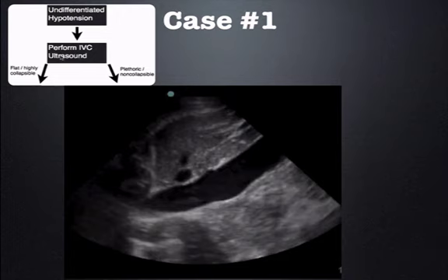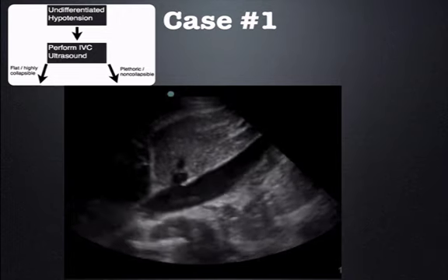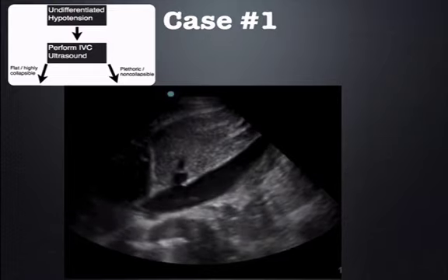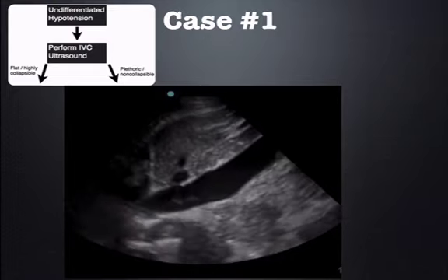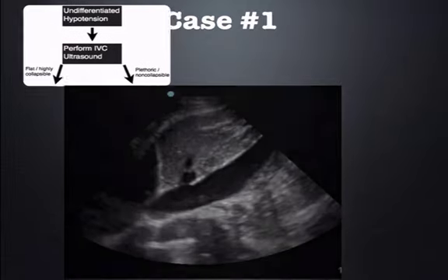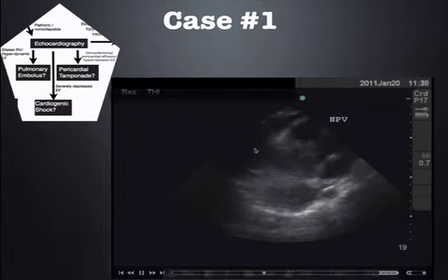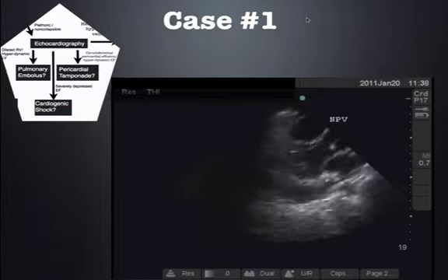and we're performing an IVC ultrasound. All right, and clearly you can see there that we have a plethoric non-collapsible IVC. So where do you want to go from here? Well, I recommend you take a look at the heart. Could this be an obstructive shock of some sort? So this is what we did. Now we have a circumferential pericardial effusion with a plethoric non-collapsible IVC.